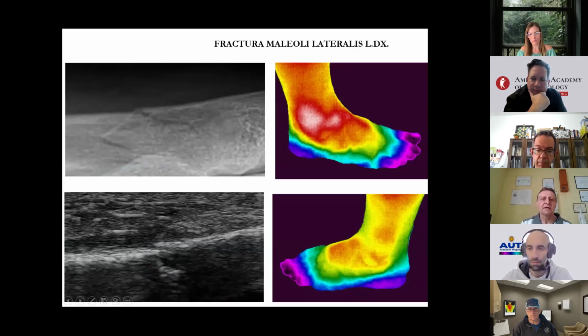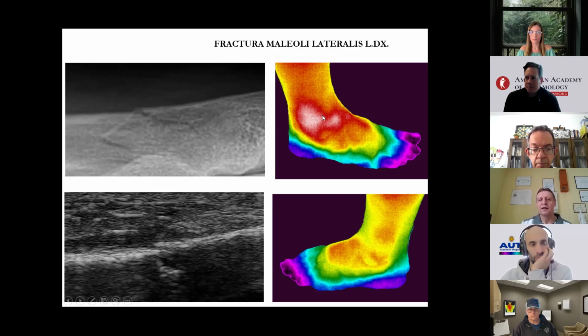Fractura malleoli lateralis lateri dextri. On X-ray and on sonography, we can see interrupted and fractured malleus lateralis. Thermographically, we can see increased temperature activity on the site of fracture.